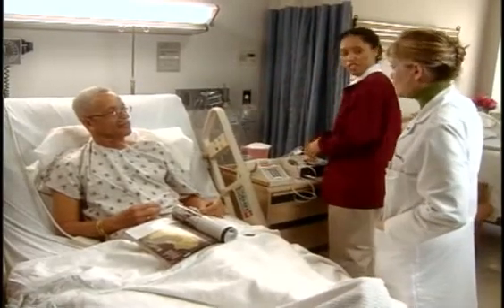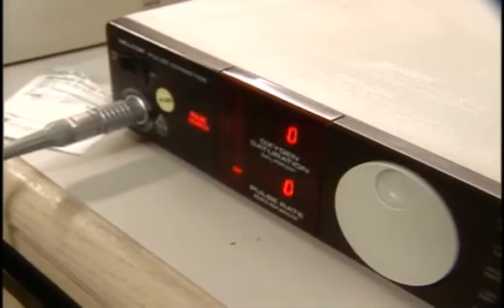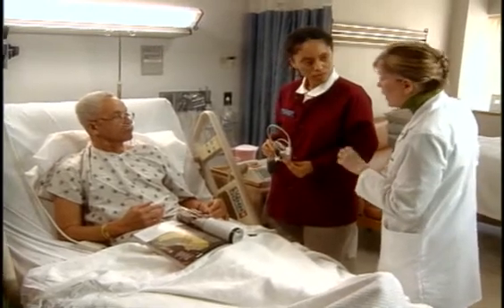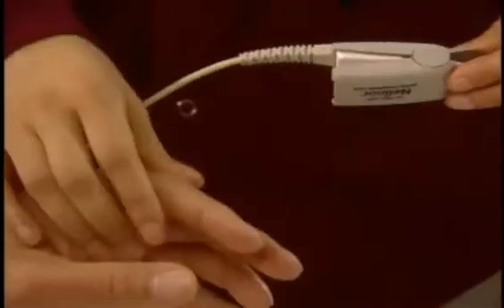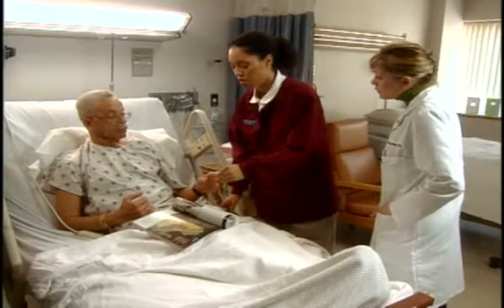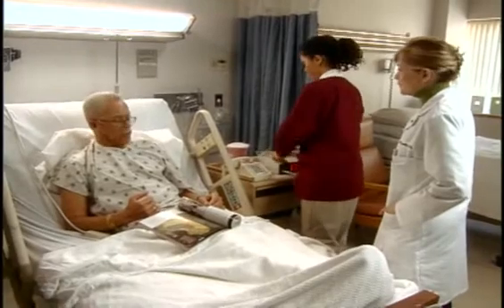Jeez, no. Okay, so now I'm going to double check the connection of the sensor probe with the pulse oximeter and, of course, the equipment. Machines will have a bar or a waveform indicating signal strength and or an audible beep. The probe has two sensors, a light emitting sensor and a light receiving sensor, and they have to be properly aligned in order to get an accurate reading. Okay, so now we're just going to place the probe securely onto the skin. Okay, I've got a reading, so I'll remove the sensor. And your reading is 100%, which is just fine.